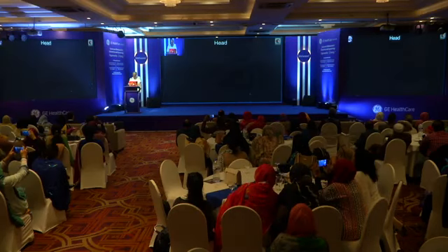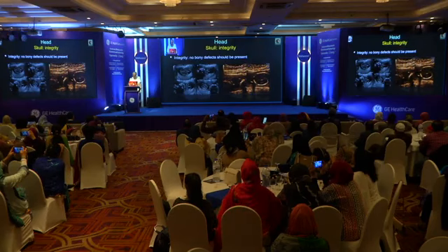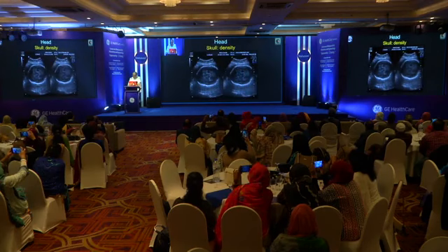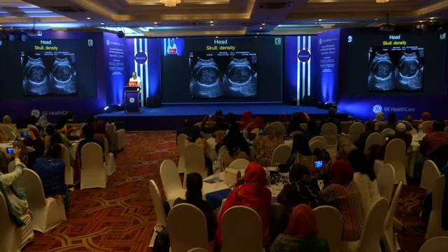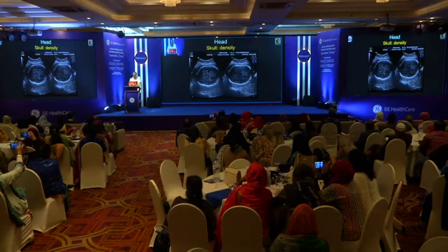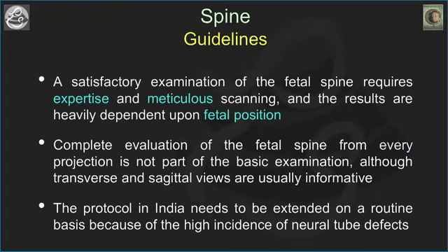You also have to remember that you have to trace the entire bone from front to back and look for any defects either anteriorly or posteriorly, and something that you and I rarely do, and that is to look at the density of the skull. If you look at the density of the skull, you have to press it. And if it gets pressed, you know it's not ossified, and that immediately tells you that you're looking at a dysplasia.